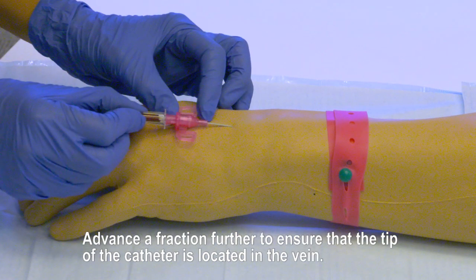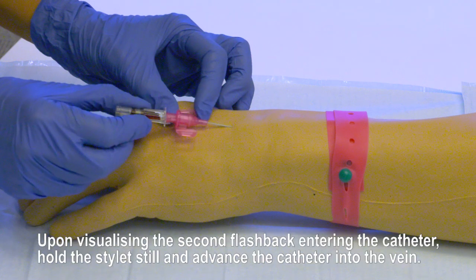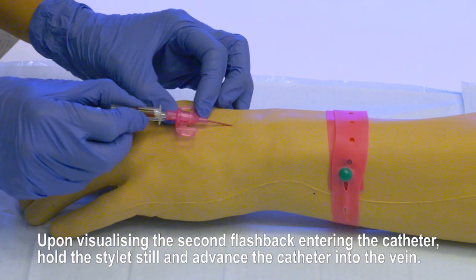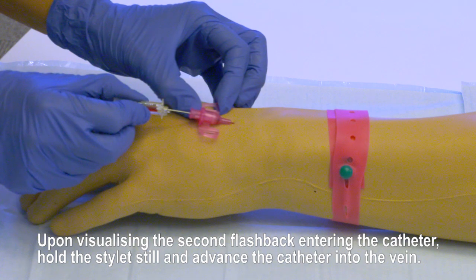Advance a fraction further to ensure that the tip of the catheter is located in the vein. Hold the wing with your non-dominant hand and withdraw the stylet slightly using your dominant hand. Upon visualising the second flashback entering the catheter, hold the stylet still and advance the catheter into the vein.